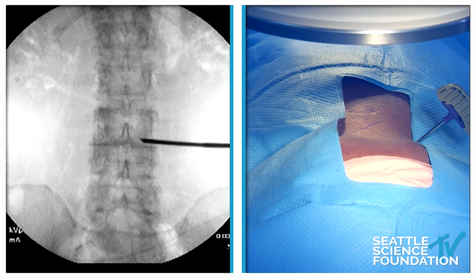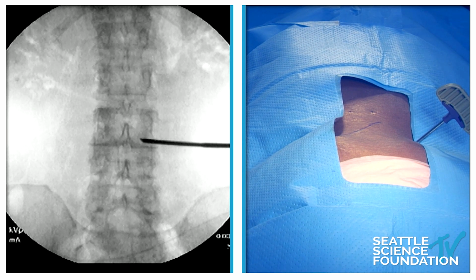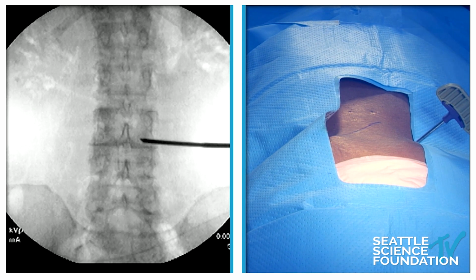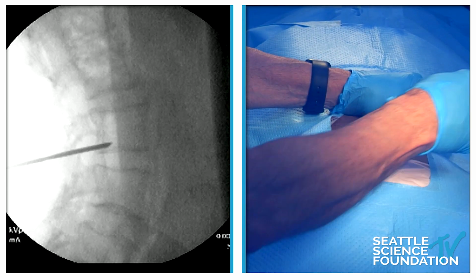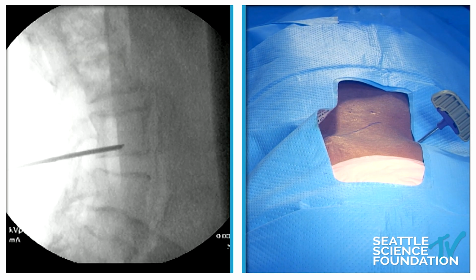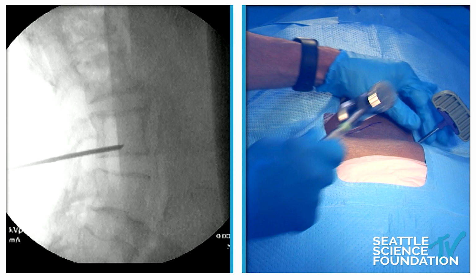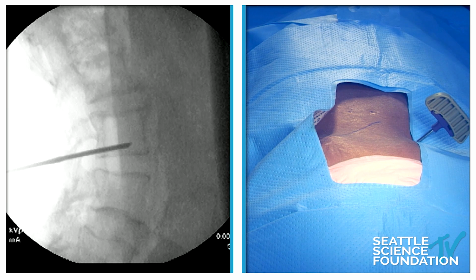Let's go lateral. If anything obstructs your way, if you have a 4-5, 5-5 pedicle screw in the way, if you can't see the pedicle because your tumor has obstructed it, if you have severe vertebral plana, if you want to put something big in the vertebral body and you can't fit it next to or in the pedicle, this is a very good way to do it. So here we have it in the mid and anterior portion of the vertebral body, and this is a lateral view. Let's come back around to AP.